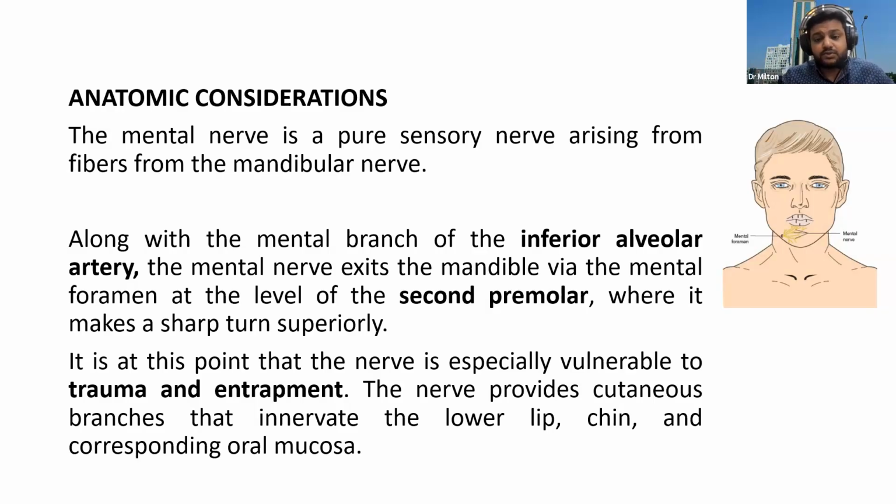Though it is sensory, there are changes of touch, tingling sensation, numbness, and some sort of hyperalgesia or allodynia. If you find this, you can plan for this nerve block.